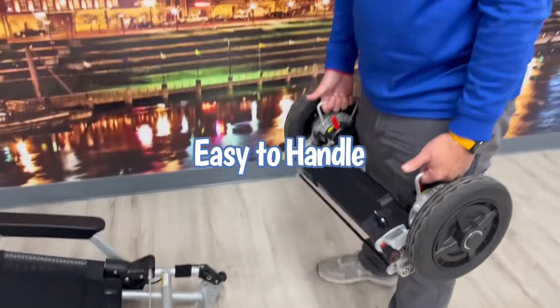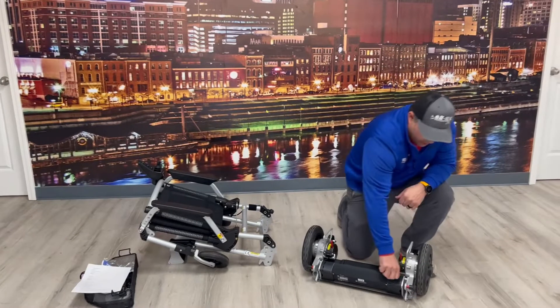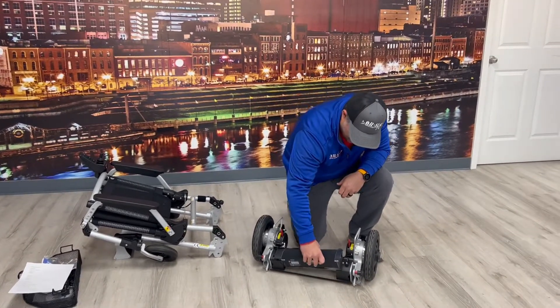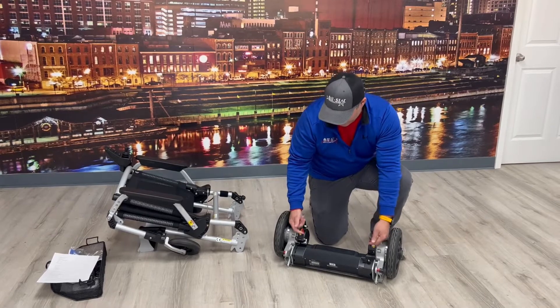What's nice is the back end has handles that you can pick it up with — the Zoomer does not have that. You can also take the battery off, which is four pounds, so if you need to make it a little lighter you can do that. You'll notice this is where you engage and disengage the motors — the levers right here.